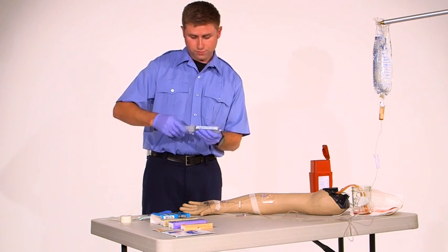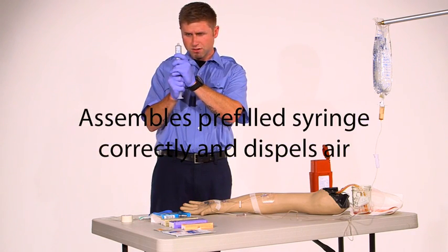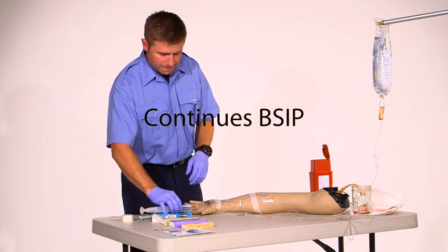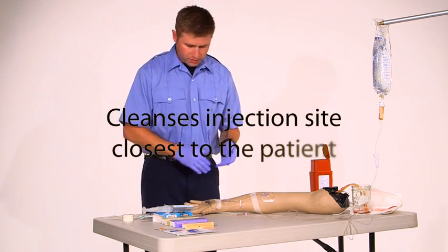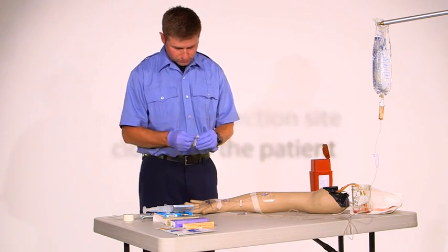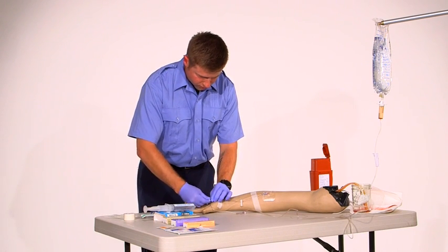I'm going to connect the plunger. At this time, I'd go ahead and expel any air that's in there. Okay, which I did. And okay, I assembled the syringe, and I am going to clean the port at this time. So I'll make sure that the port on here is nice and clean.